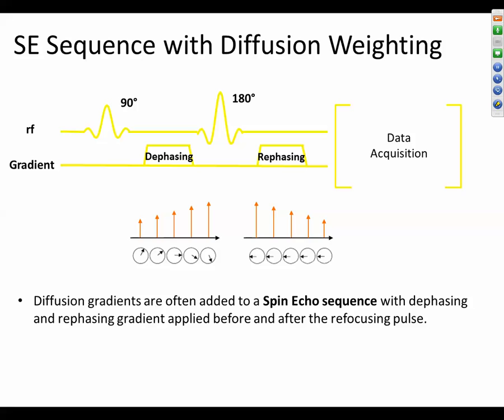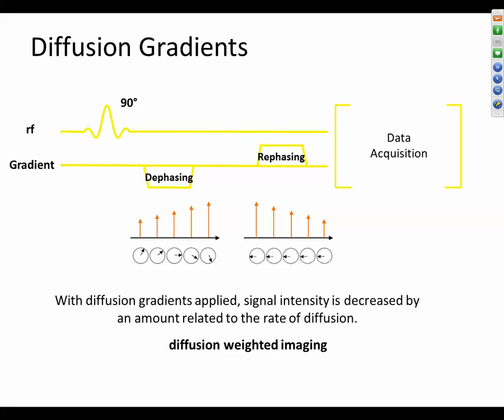So we're measuring the loss of signal and calling that signal? Yes, we measure the signal and we can calculate the signal loss, and this loss is related with diffusion.